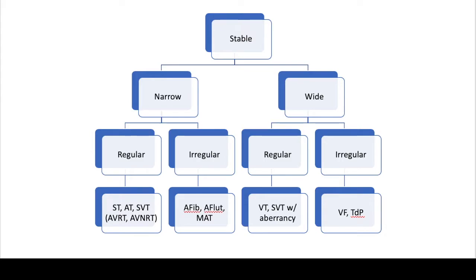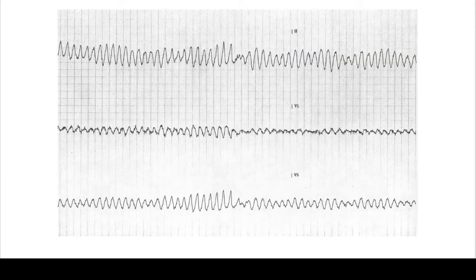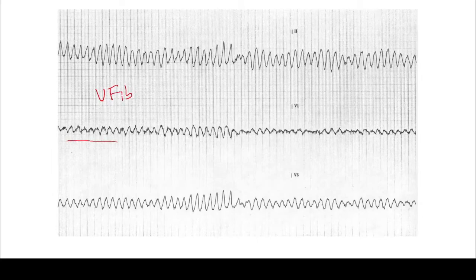Here we have an example of V-fib, and we see this kind of irregular wide complex tachycardia. There are no distinct QRS complex morphologies. It's much different than the polymorphic VT that you could see.